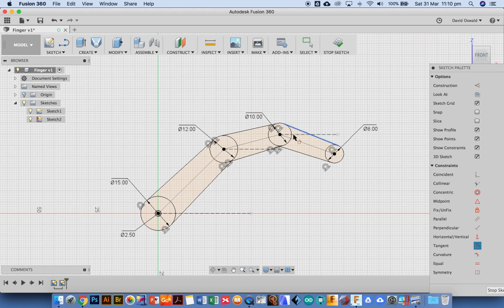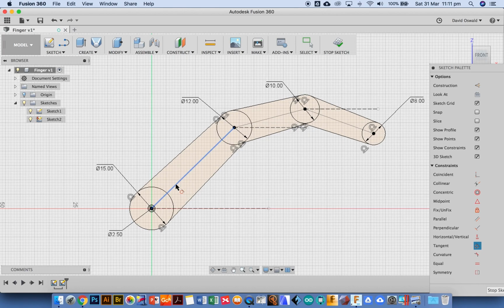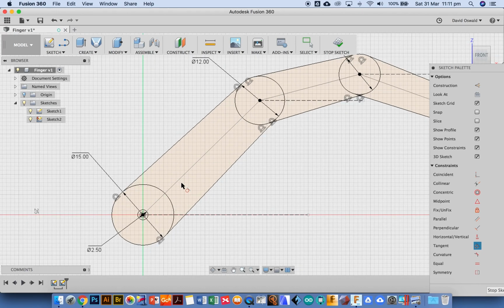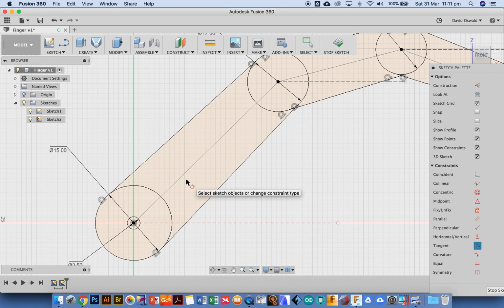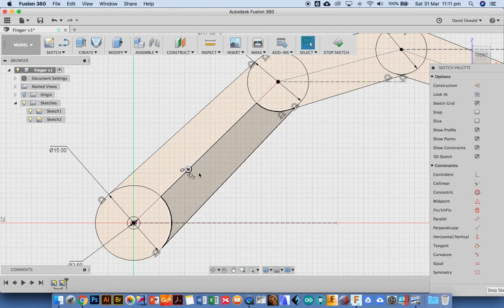Okay, so what I've got at the moment, I've got all of the things. I've got the hole for the mount in the middle. I've got control. There's one little point here. On the servo horn, there's a tiny little circle. I want you to add this one too. It's just to position something. I want C for circle. I want you to lock onto this line. It's a tiny little hole, so it's 1.321. You go enter. Enter again.